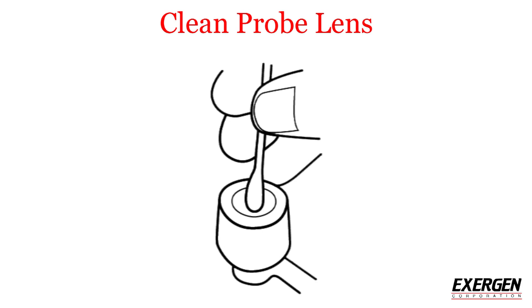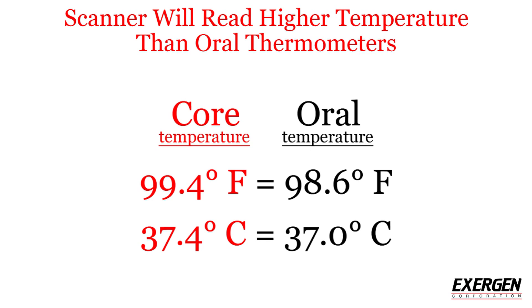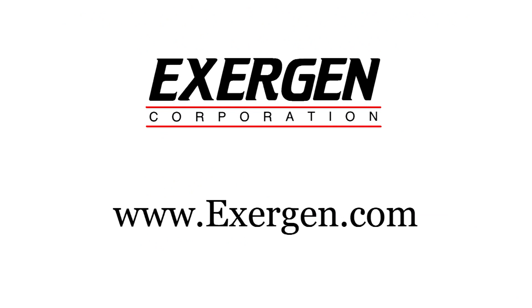Clean the probe lens with a cotton swab dampened with an alcohol prep pad. The Exergen temporal scanner thermometer measures core temperature, which is normally 0.8 degrees Fahrenheit or 0.4 degrees Celsius higher than oral temperature. Therefore, the average normal reading would be 99.4 degrees Fahrenheit or 37.4 degrees Celsius. For more information, please visit exergen.com.